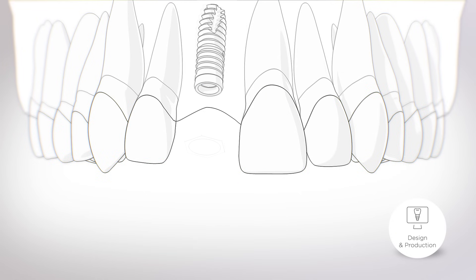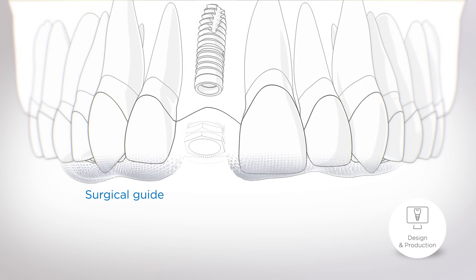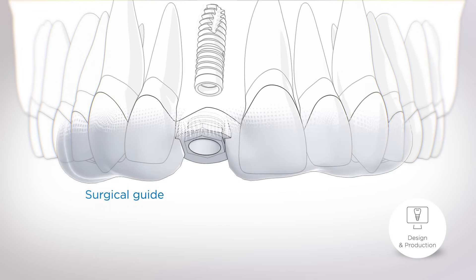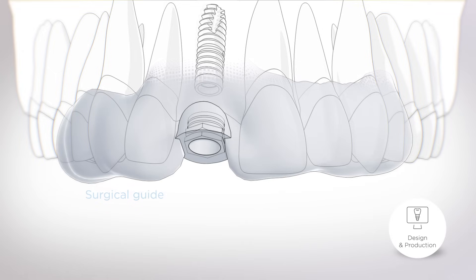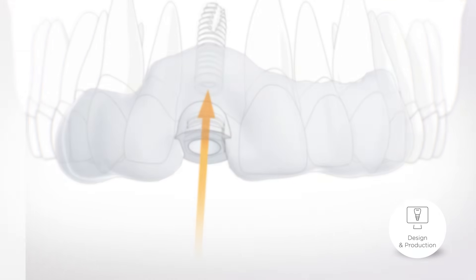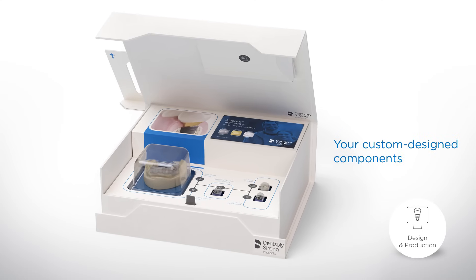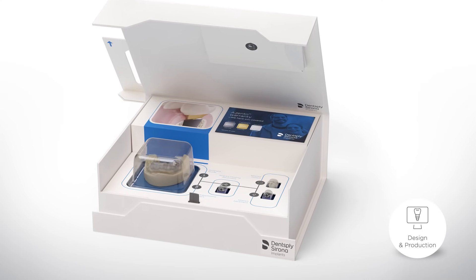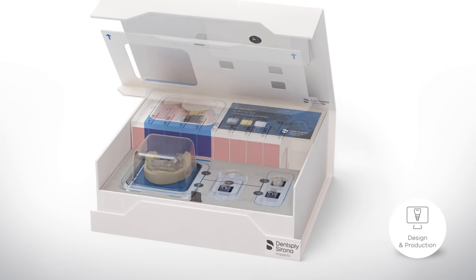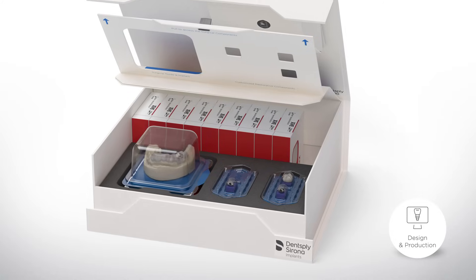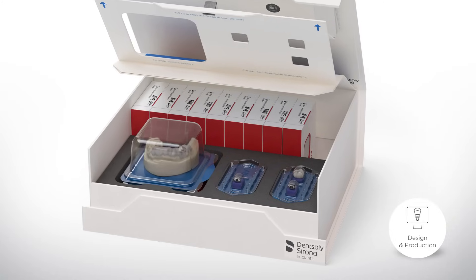An individual, so-called surgical guide is designed to accurately convert the digital design into reality. The surgical guide is designed to fit over your teeth so the implant can be placed into the exact, planned position. All of the customized components required for an accurate and safe treatment are produced and arranged in your personal Azento box, in preparation for your third step.